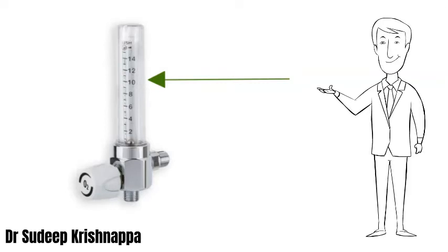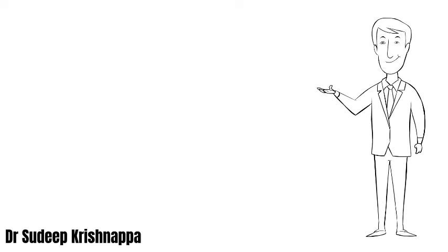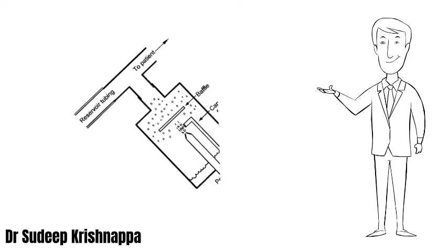The other common problem you are likely to see is this: everything is going on well. The nebulizing chamber is attached to a face mask which is strapped onto the patient's head. Intermittently, you might find the aerosolization stops. Apart from ensuring that there is enough fluid in the chamber, the other important reason you can see this problem is if the nebulization chamber is not upright.